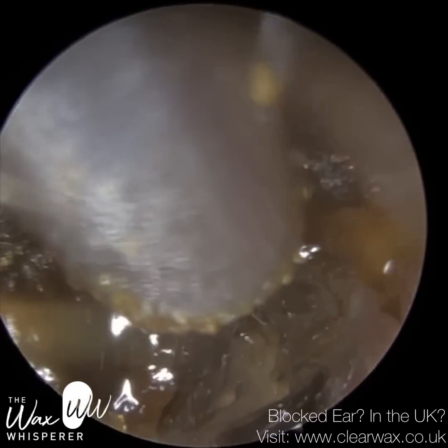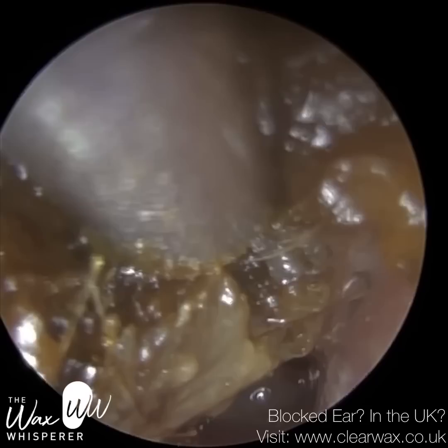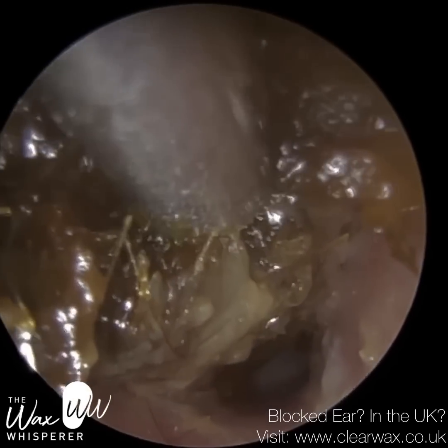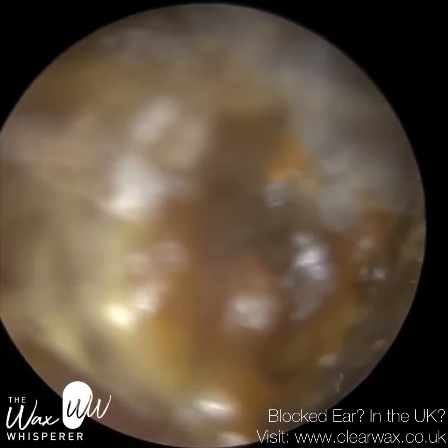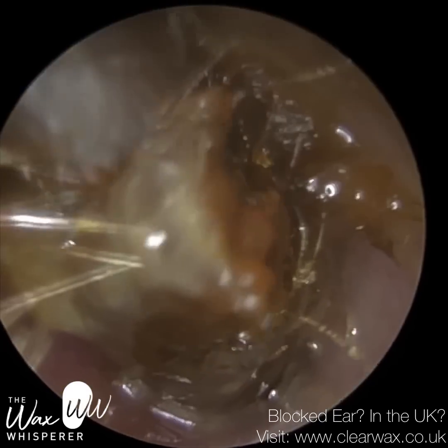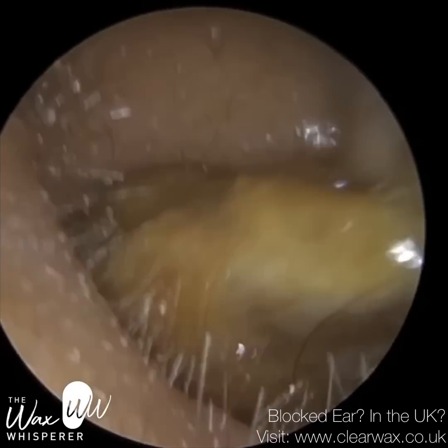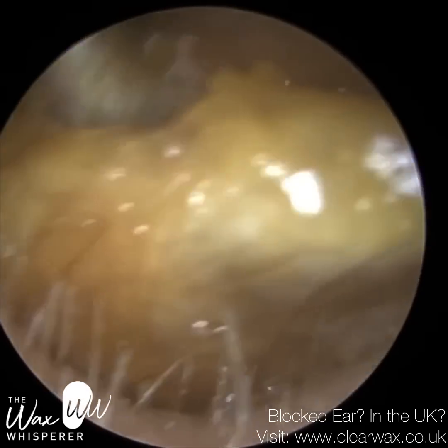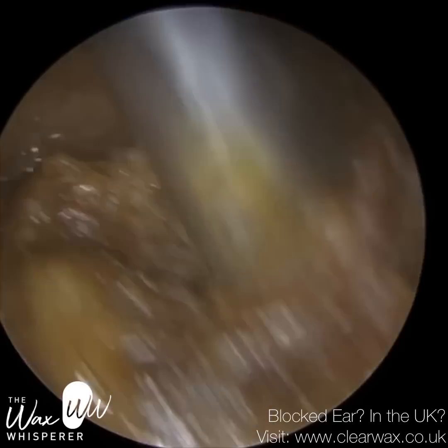So these hair strands that you see in the ear on the outer third, at the root, at the follicle, you have a sebaceous gland that secretes sebum, and living on the skin is healthy bacteria and fungi. We call it skin flora, and the bacteria feed on the sebum, and they produce and release a carboxylic acid, and the sodium bicarbonate reacts with that acid.